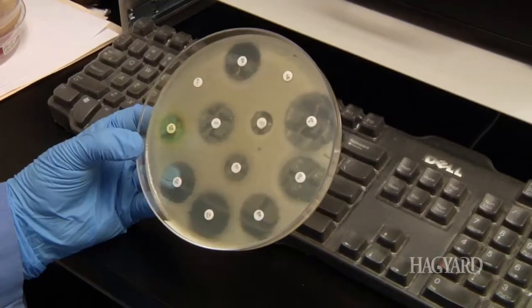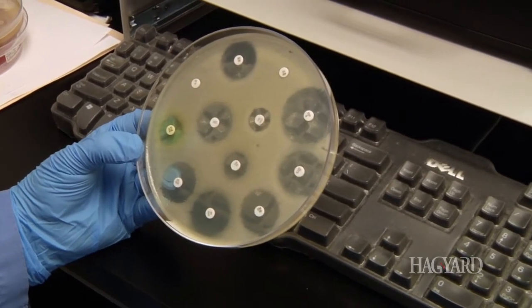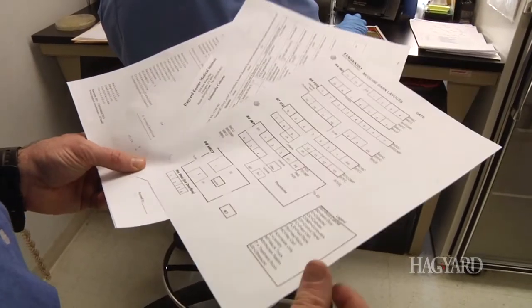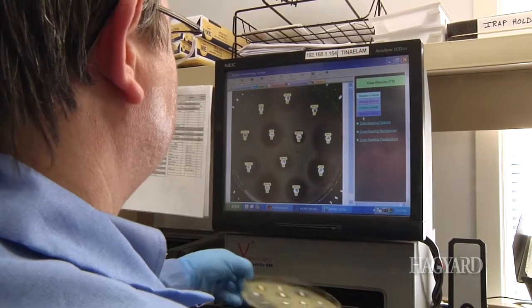And then this information will be given to our infectious disease officer, who will utilize this information to track and monitor any infectious diseases. Now with these antibiogram reports that Tina is currently producing for us, I can utilize this information on our patient to determine, did it come in with salmonella or could it have potentially acquired it at our hospital? So with this information, we can determine if any sort of biosecurity procedures need to be implemented to help protect that patient as well as our hospital from potential infectious diseases.